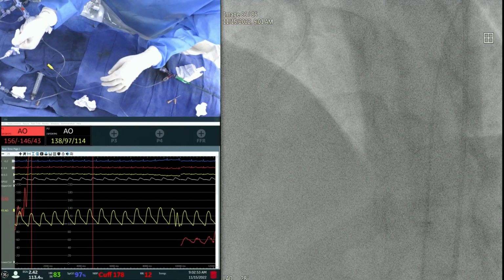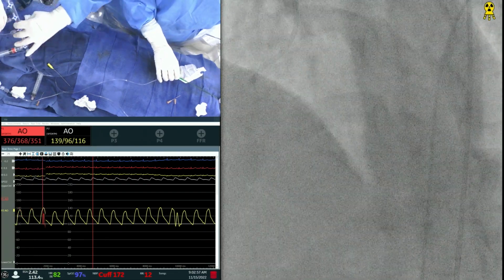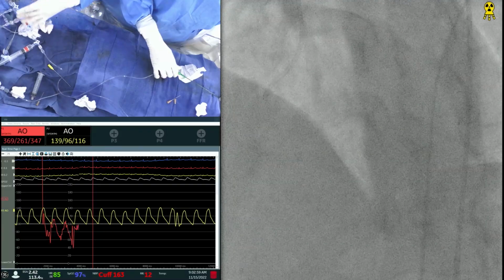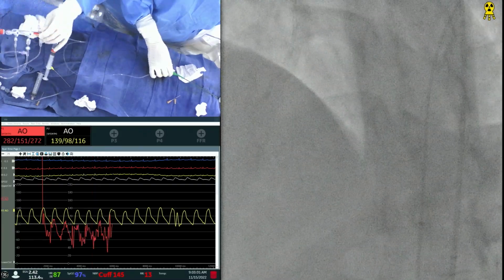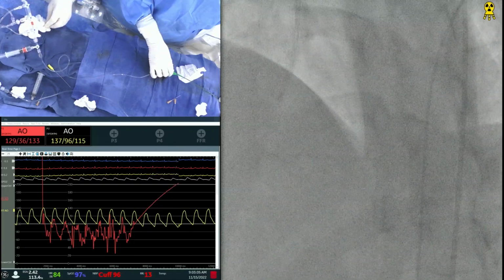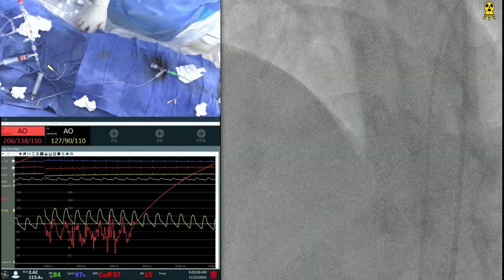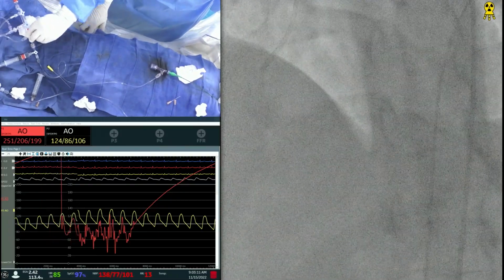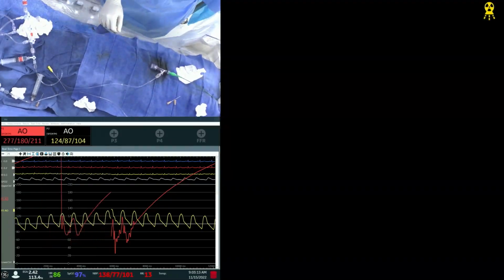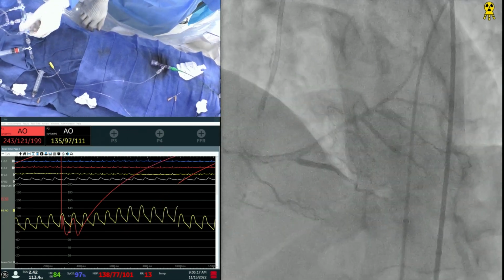Okay, vasodilators going in. Right. That'll plump up the vessel. I'm going to get the guide out a little bit. Yeah. So good. Okay, ready? Yep. All right. Wow.